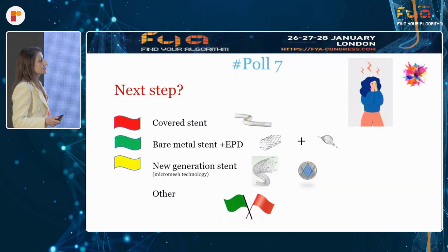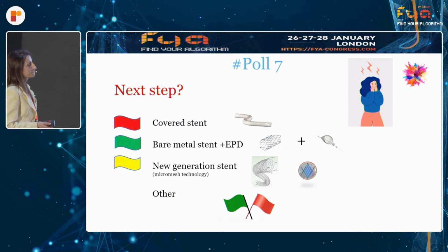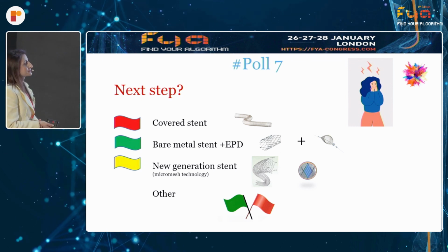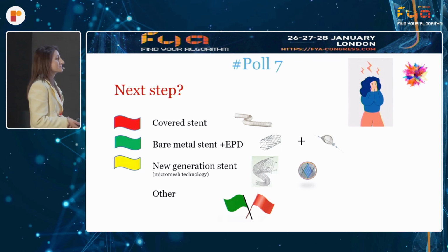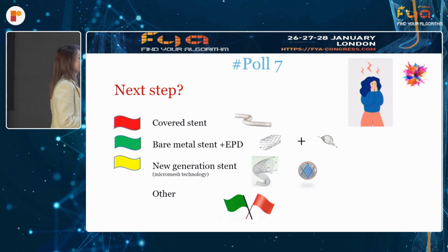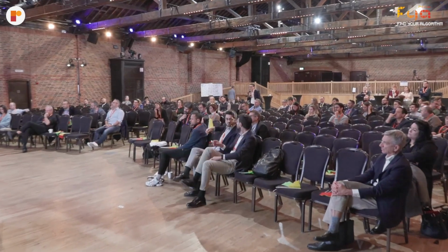So you mentioned this situation this morning, some residual thrombus in this area. Probably, what would be your choice in terms of stenting, covered stent, or any sort of stent, and why? Yeah, in this situation, I think the thrombus aspiration was partially successful, as there is flow again.